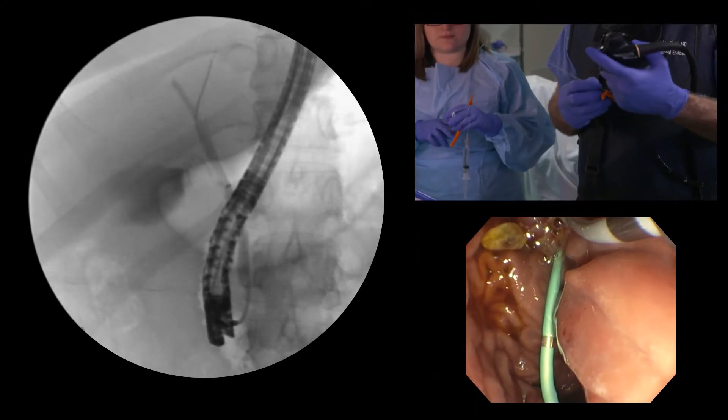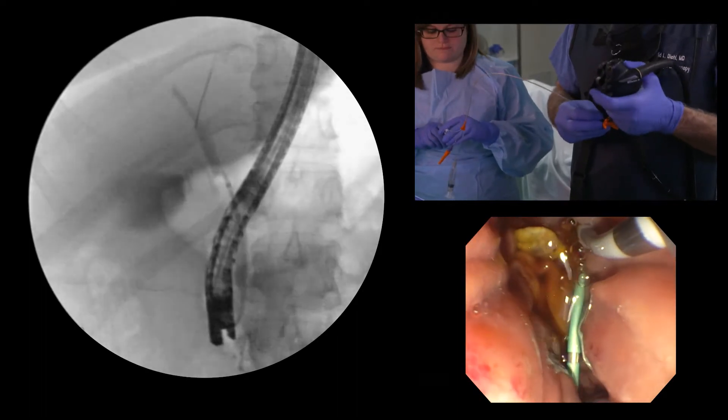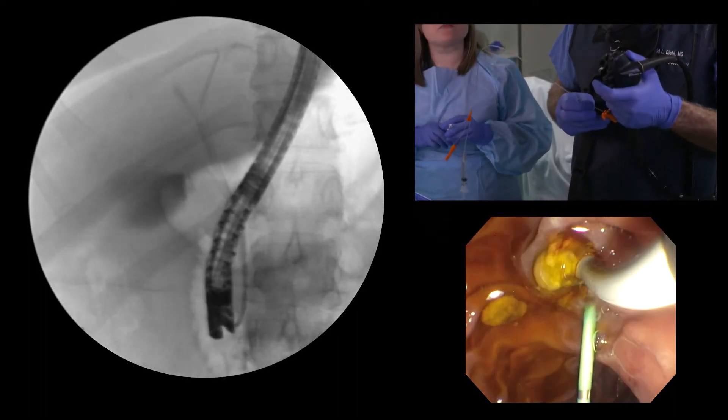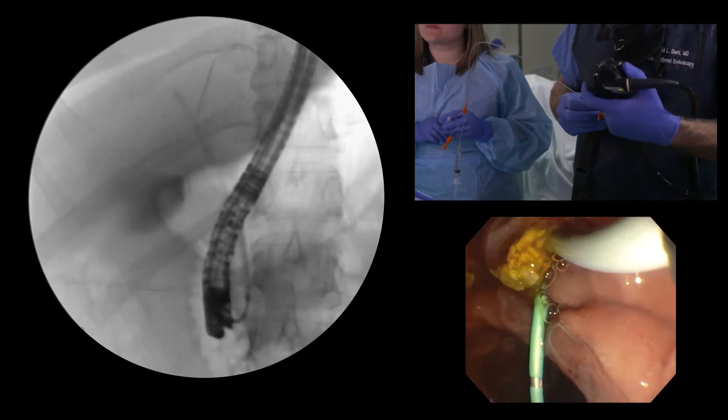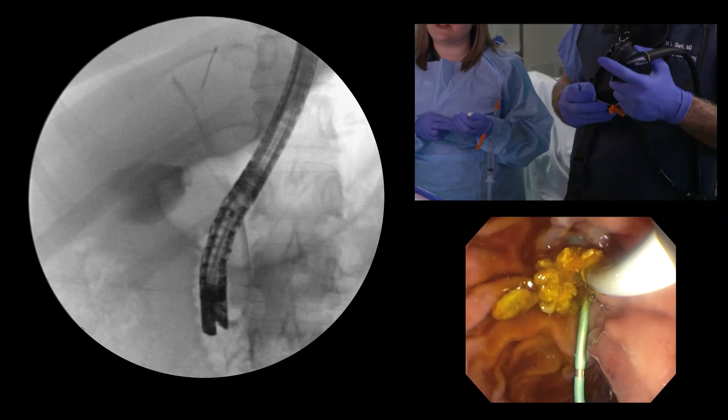So now I went distal duct; now we'll go mid-duct. Inflate the balloon — eight and a half. There's another one. Sludgy stones, you might say. Deflate.